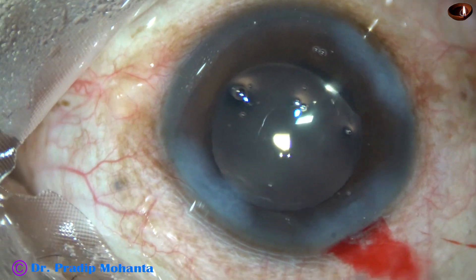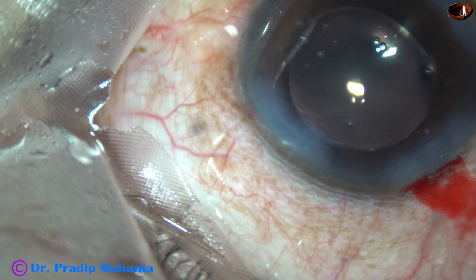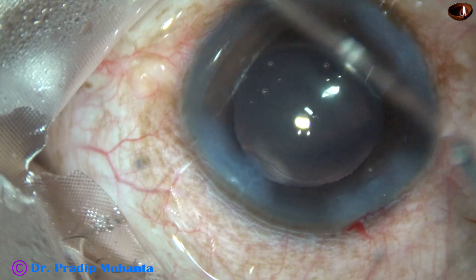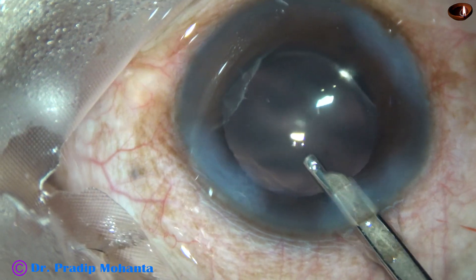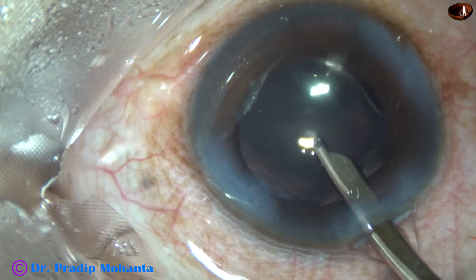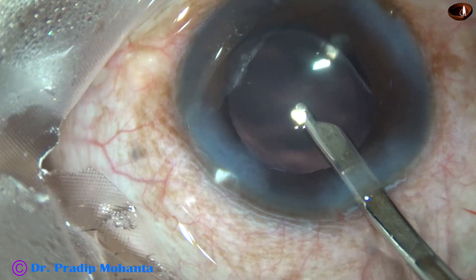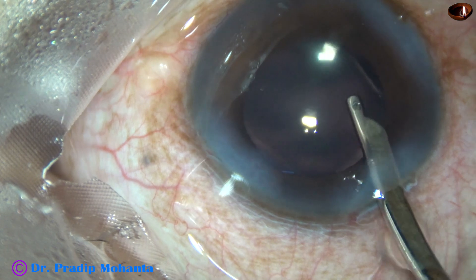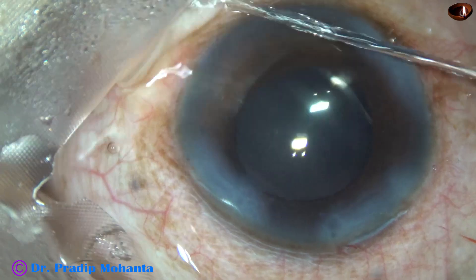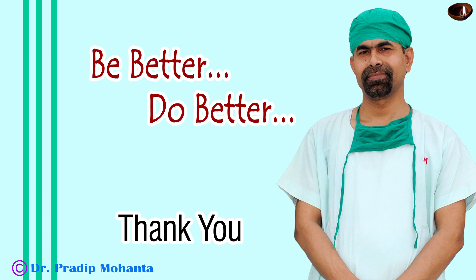The side ports are closed by hydrating the corneal stroma on either side of these stab wounds. This is the final lavage of the anterior chamber — whatever viscoelastic sticks to the corneal endothelium is removed by the Simcoe, directing a gentle stream of BSS toward the endothelium. The anterior chamber is nicely formed and the case is concluded. Be better, do better.